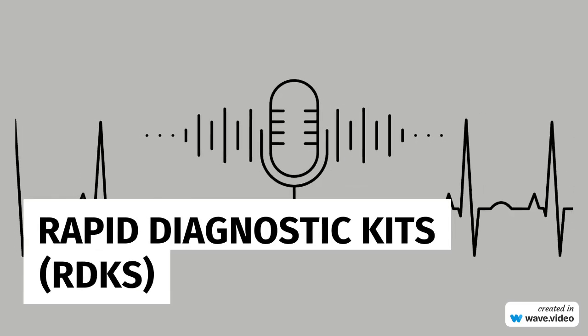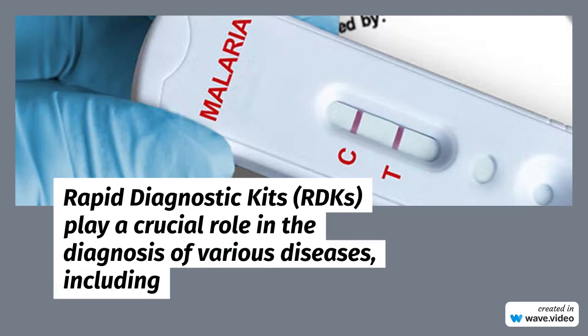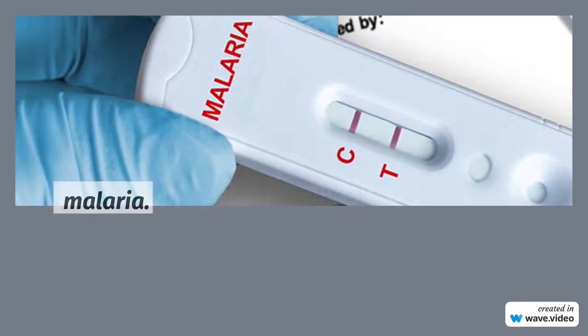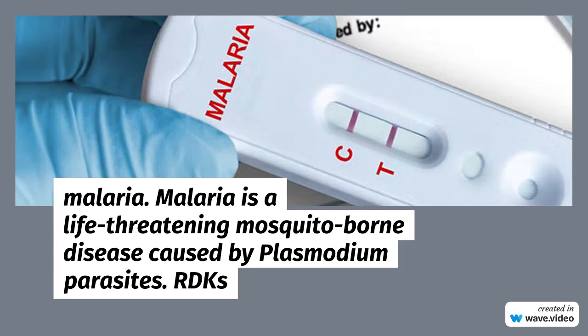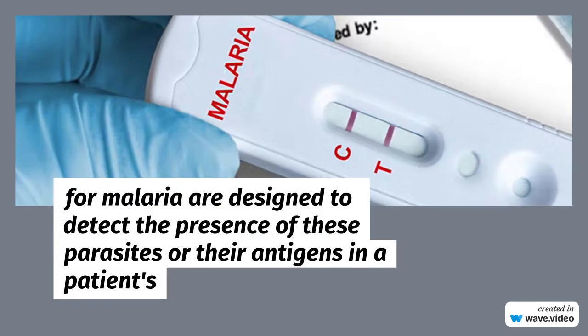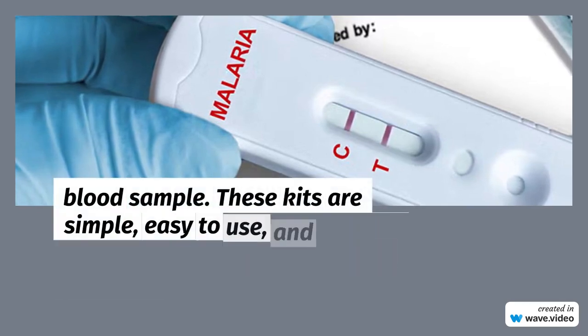Rapid Diagnostic Kits, RDKs, play a crucial role in the diagnosis of various diseases, including malaria. Malaria is a life-threatening mosquito-borne disease caused by Plasmodium parasites. RDKs for malaria are designed to detect the presence of these parasites or their antigens in a patient's blood sample.